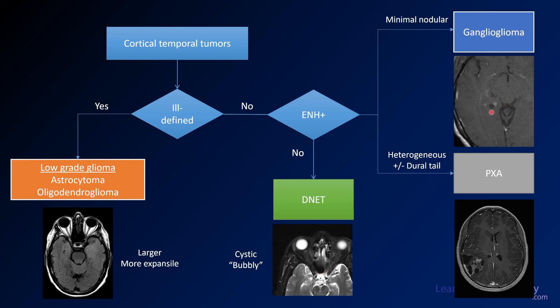If you do have minimal nodular enhancement, and you have a lesion in the medial temporal lobe with a little cystic portion and a little nodular portion, think about ganglioglioma. If you see lesions that are more heterogeneous and maybe have a dural tail like you see here, think about PXA, or pleomorphic xanthoastrocytoma.